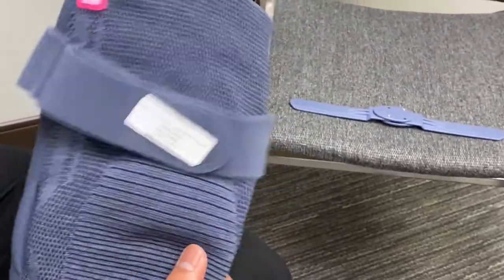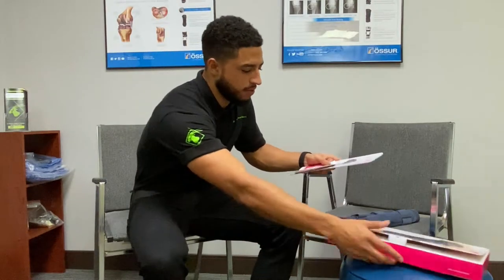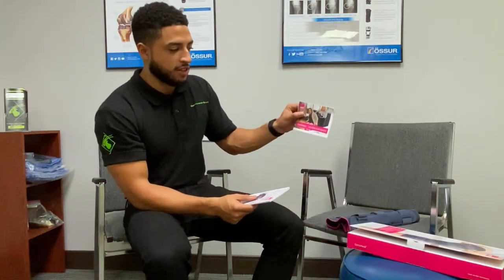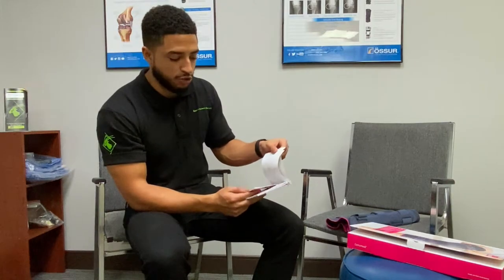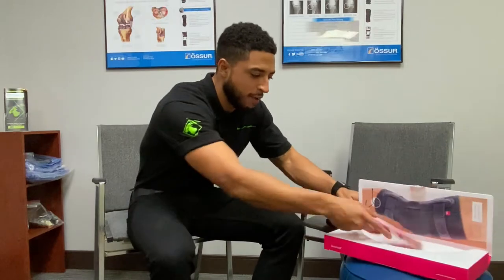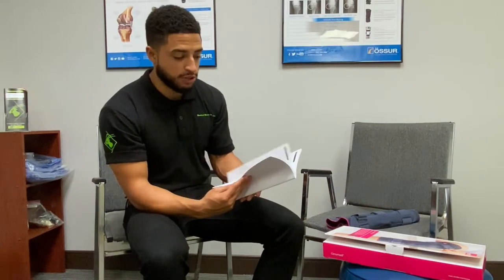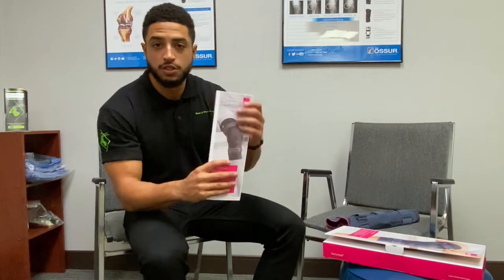There are instructions in the box as well. There are also other videos on YouTube that you can look up to find more information on the compression and some of the other braces we carry. This is the manual.